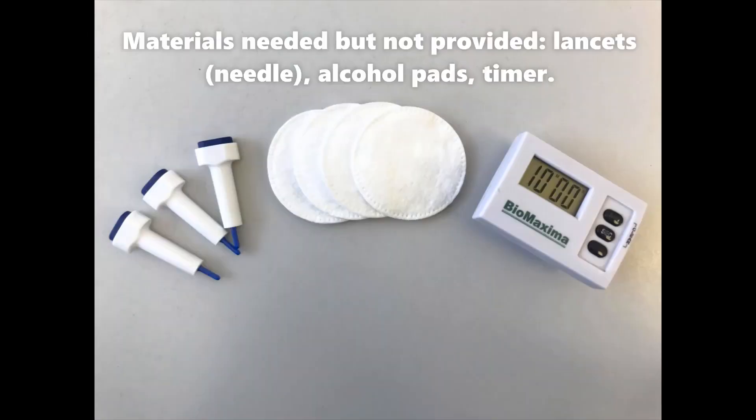Materials needed but not provided: lancet or needle, alcohol pads, and timer.